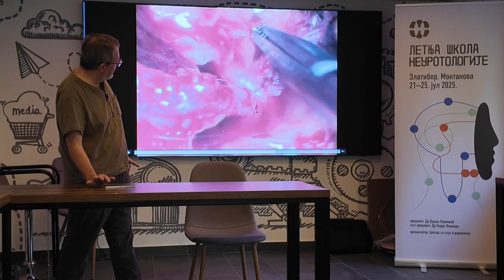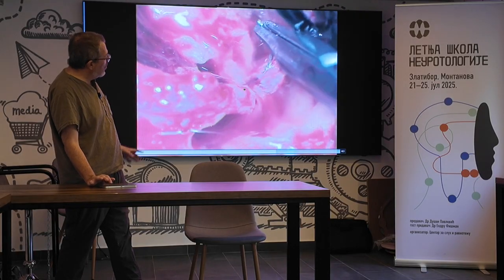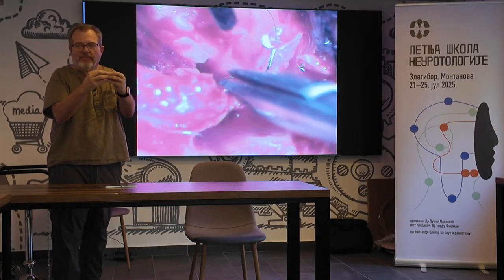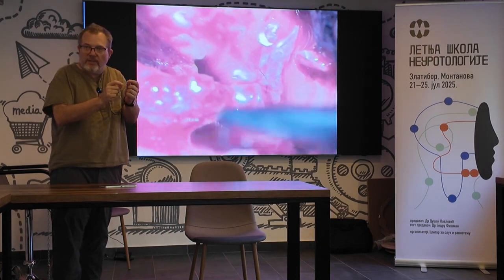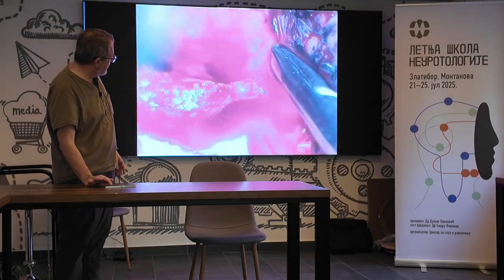This is all spinal fluid because he has a fracture through the inner ear. And I'll put a stitch right through, and you only need to do like 2, 3 maximum. You just need the nerve to actually touch at the ends, because it'll regenerate right across. You don't have to be so specific, just get the outside of the nerve to touch, the ends to touch and not to move, okay?